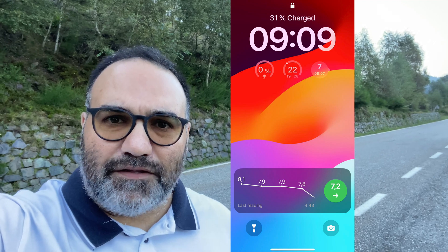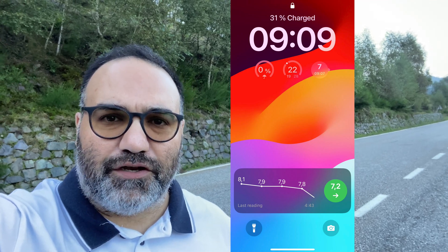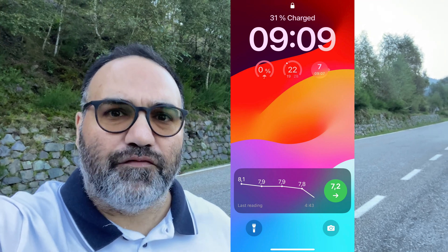I use the Freestyle Libre 3 system, and as you might know already, you can see the results on your iPhone. However, you have to unlock your iPhone in order to see the results.